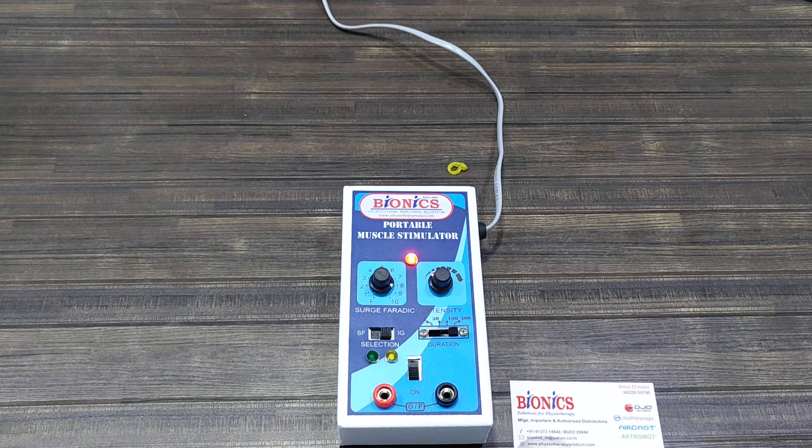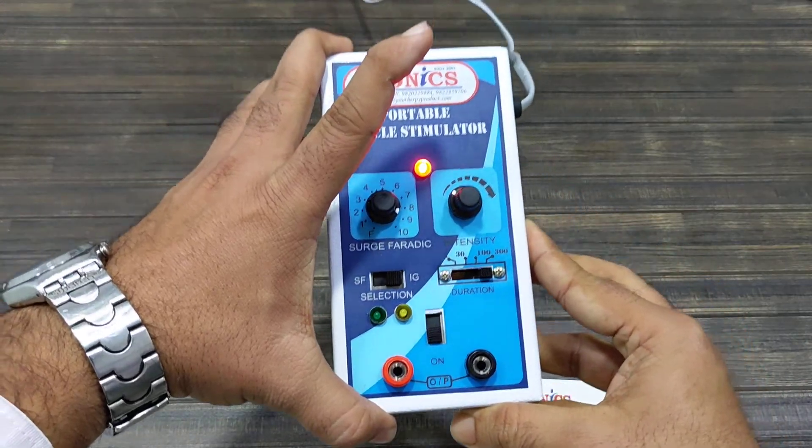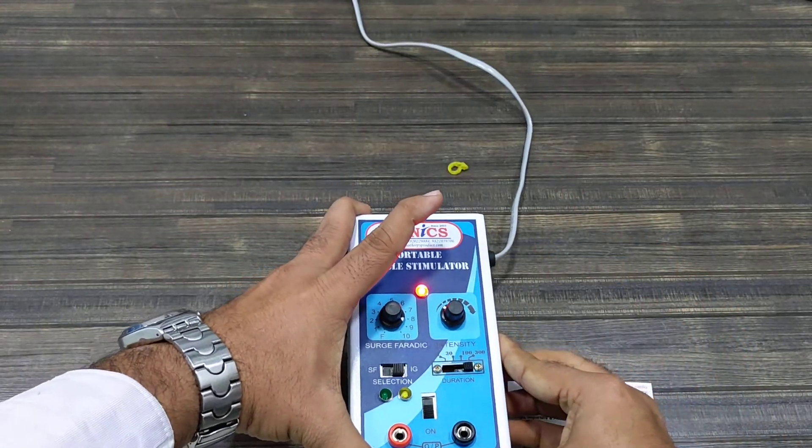Bionics Innovation Portable Muscle Stimulator with three outputs: faradic and interrupted galvanic, with different types of pulse durations — 1, 30, 100, and 300.